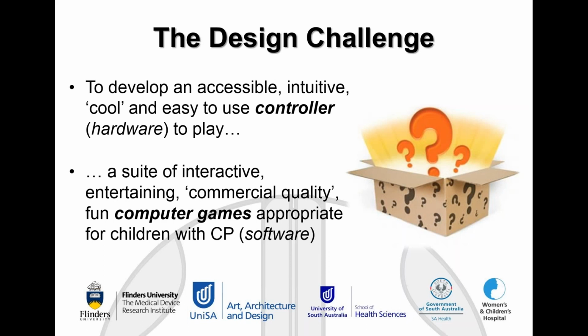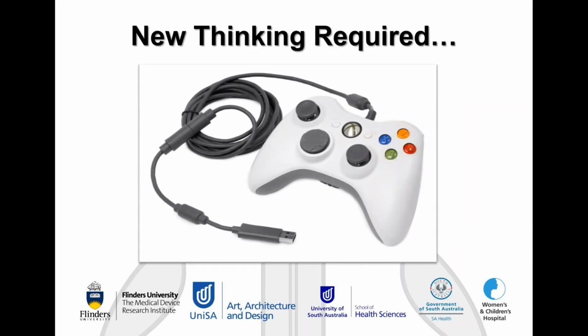And so I want to just reinforce that from a design perspective, we use that universal design or inclusive design approach to not start with what we thought might be the outcome, but just what we knew would hopefully solve the problem. So this is one of the problems that we tried to address, and this is an Xbox 360 controller, and immediately you can see those 4 color buttons which are used in every game. You can see the circular button in the middle. I might be able to use my mouse here. The circular button with the X on it, that's actually a button. There's 2 small buttons here, and from a universal design perspective we'd say that they're very poor because the contrast is very poor.